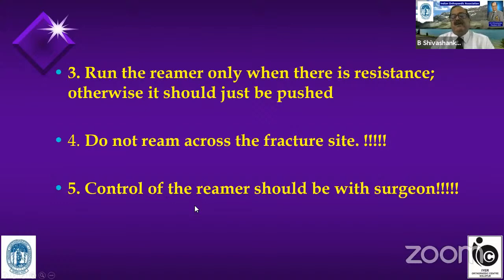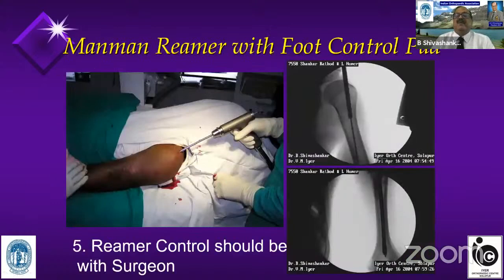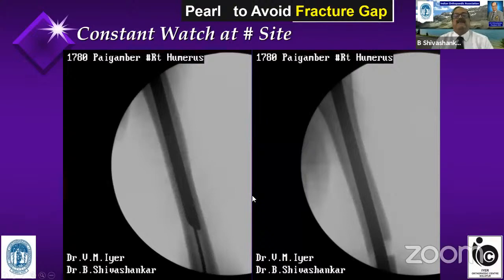Control of the reamer should be in the hand of the surgeon. Why I am telling is, in India, many of us use the Manman reamer, where the foot control is there. Though there is a hand piece, the control of the drilling is in the foot. So the foot control should be with the surgeon, not with somebody else.